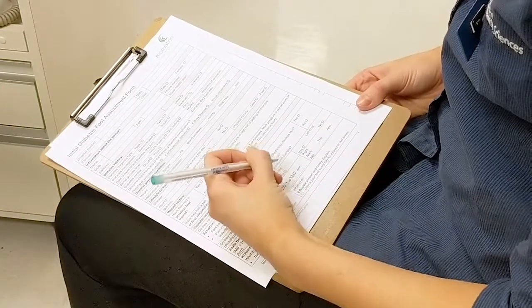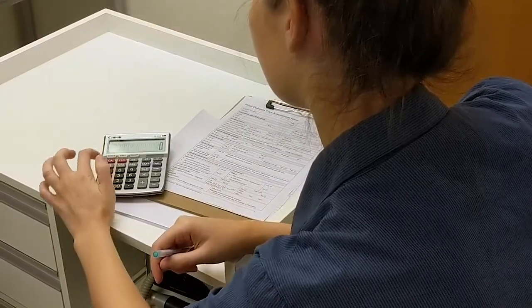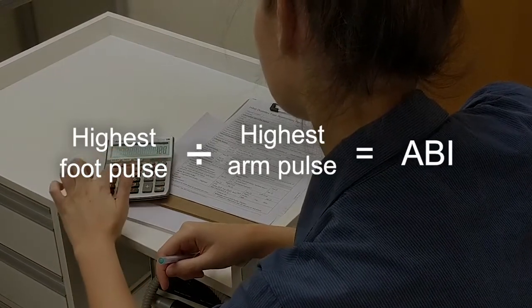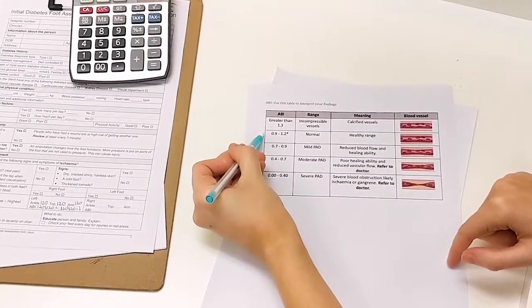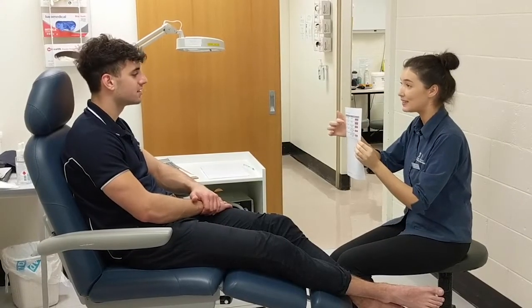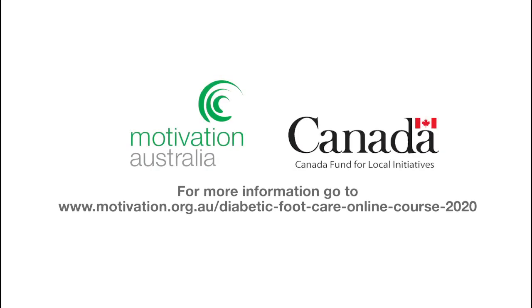Repeat this process for the foot and arm on the other side. Calculate the Ankle Brachial Index or ABI by dividing the highest systolic pressure reading on that foot by the highest systolic pressure reading of either arm. Use the table to interpret what the ABI you have found may indicate. Explain the findings to the person and discuss and agree on any actions and appropriate follow-up.